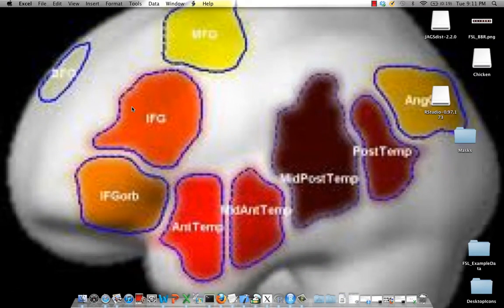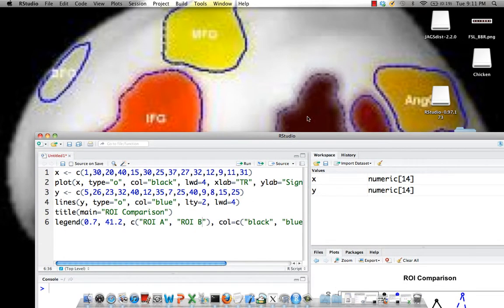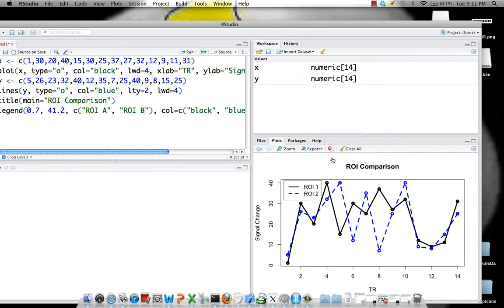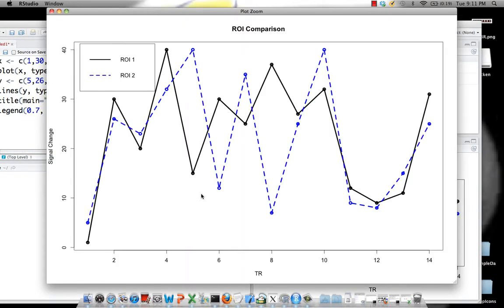Furthermore, you can use region of interest analysis to do things like functional connectivity. In other words, if you're interested in seeing whether the time series averaged across all the voxels in that region correlates significantly — you can see that here in this graph I've created in RStudio — you might see two time courses like this with some standard error associated with each observation. Those two would be correlated and you would see whether there is a significant correlation between those two regions or not.